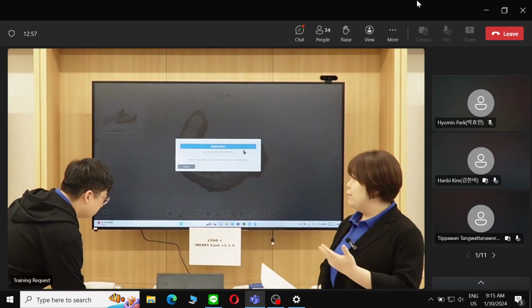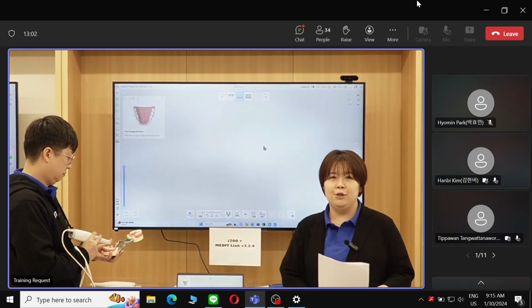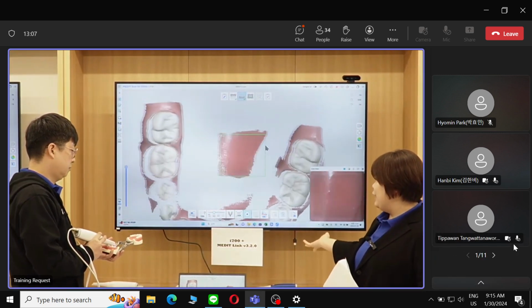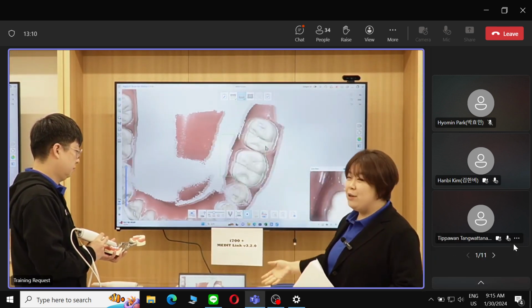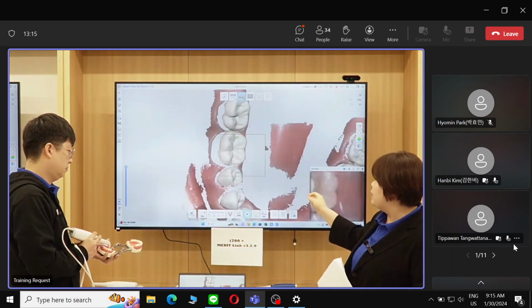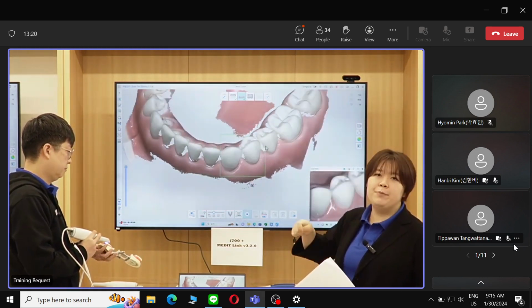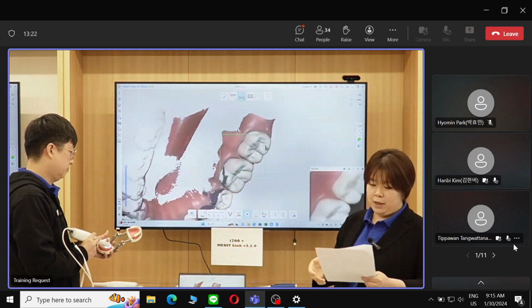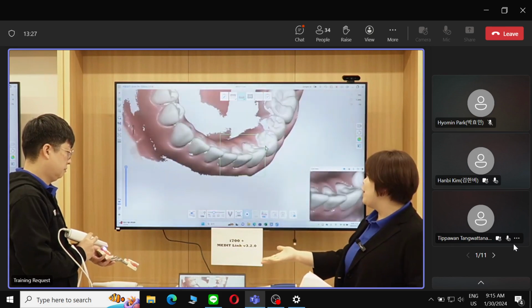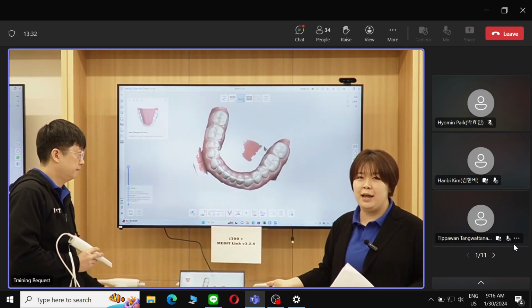And we'll do a mandible scan once again. So you'll be able to see that we're able to scan, and either there are no interruptions, or even if there were interruptions where data recognition has failed, the scanner is able to come back to its track quite a bit faster. So the experience overall becomes a lot more smooth, like we were saying. So let's just allow Mr. Yang to finish the arch scan, the mandible scan, so that we can proceed to the occlusion scan.